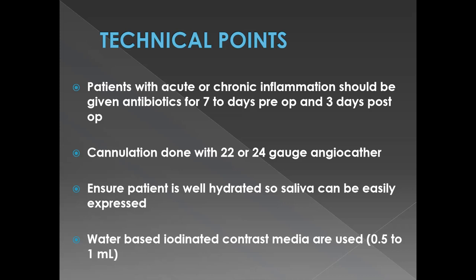Second of all, if you're still having trouble, then you can give the patient some citrus foods like lemons or oranges to increase the amount of salivary flow. So once you've located the orifice of the duct, the second step is you take usually a lacrimal probe, a Bowman's probe basically, and you slowly enter the orifice of the duct, and you move it in circular motion so the duct orifice becomes enlarged.